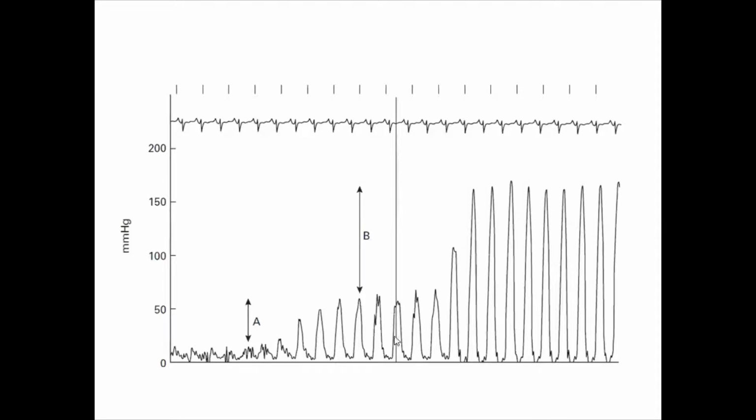If it is a withdrawal or pullback, it will be from the pulmonary artery to the RV. But here in the RV, I have what looks like intraventricular gradients. Letter A and letter B indicate a significant gradient.